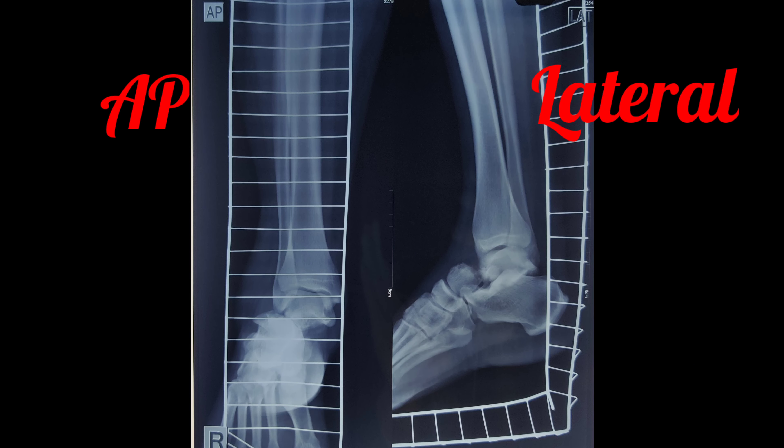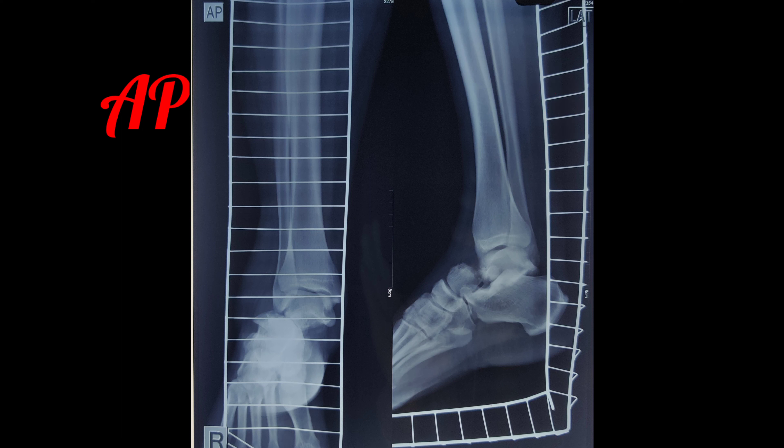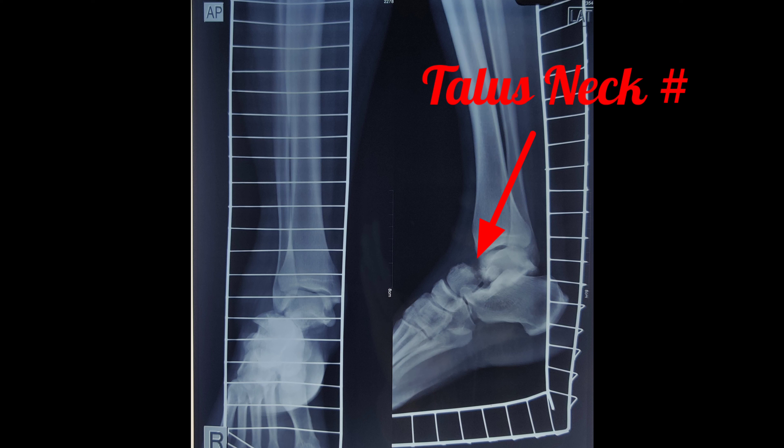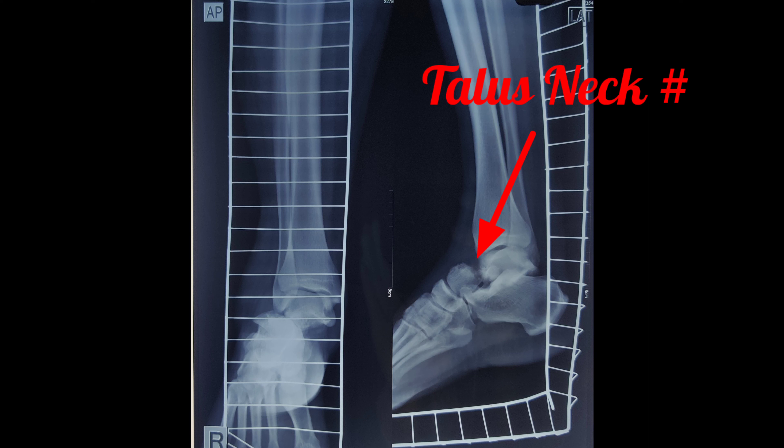An x-ray was ordered and these were the x-rays that we got — the anteroposterior and the lateral views of the same patient.